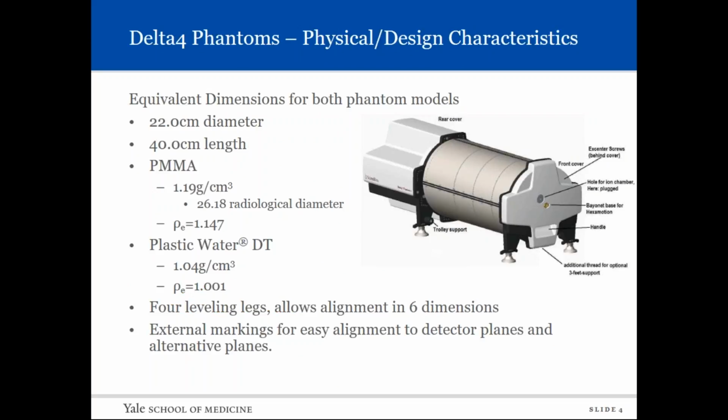So with that said, let's introduce you to the Delta4 Phantom a little bit. The physical characteristics of it: it's a 22 cm cylindrical, or 22 by 40 cylindrical piece of plastic.